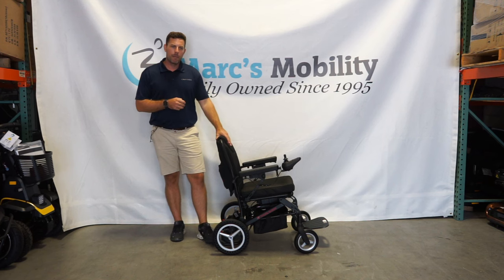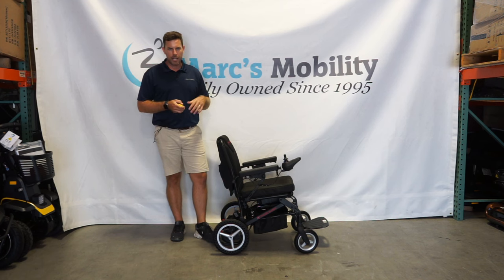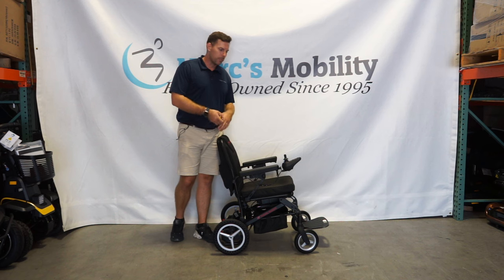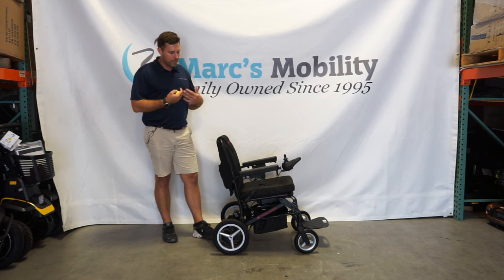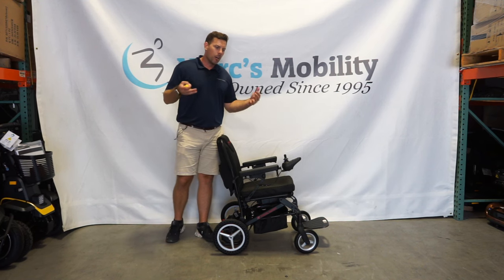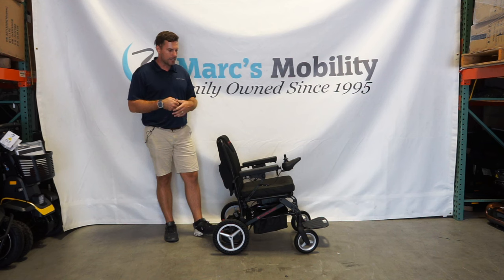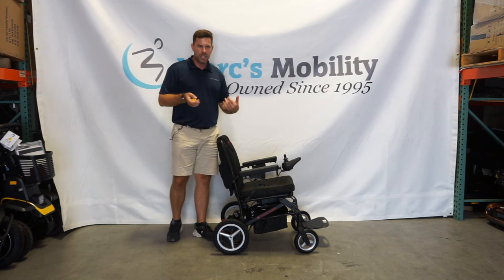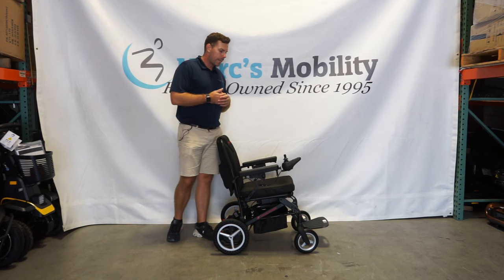It does have about a 265 pound weight capacity and gets up to 9.5 miles on a full charge, depending on the terrain, the incline, and the weight of the user. It is a chair that does fold up. The total weight is 49 pounds with the battery in it. You can pull the battery out and it weighs about 45 pounds. If you want to go extreme and pull the joystick and seat off, you can get it down to about 42 pounds.